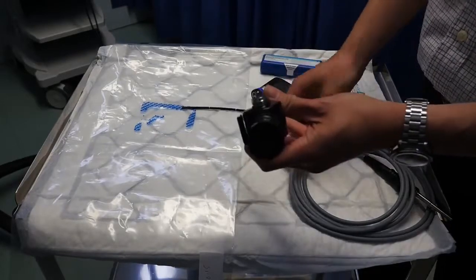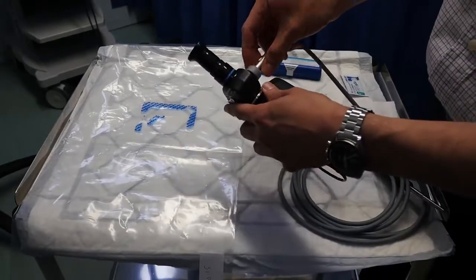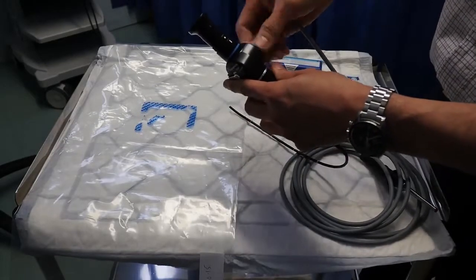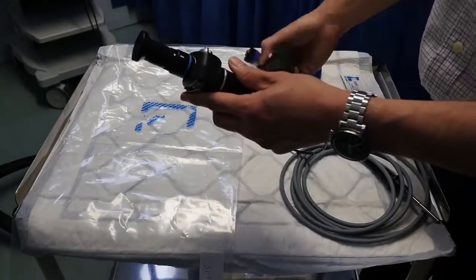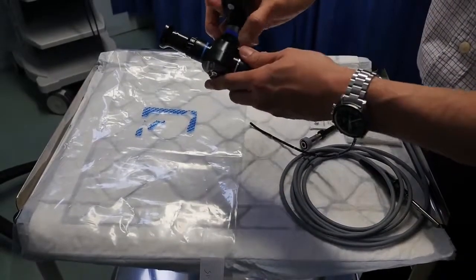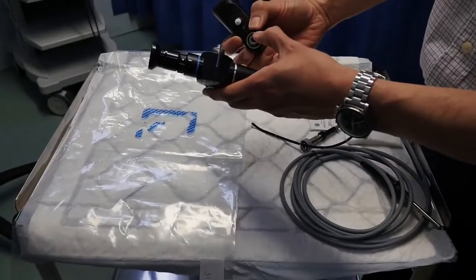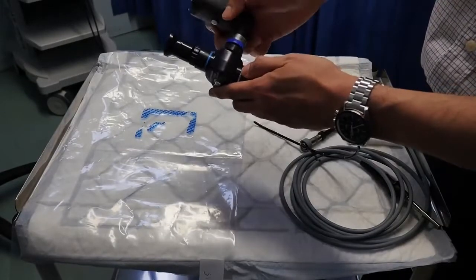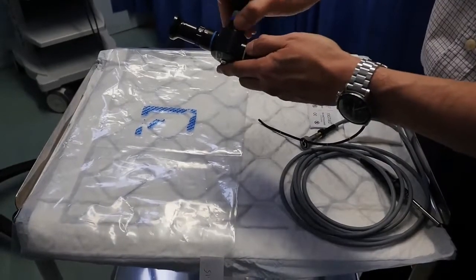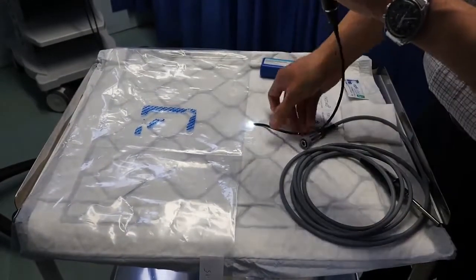So there are two ways to attach the light with a cable. It's pretty straightforward. Just put it on and screw it on. And with the battery pack, there's a little notch over here, and if you put it on, you feel it suddenly go in, and after that, just lock it in place. And that's the battery light over there.